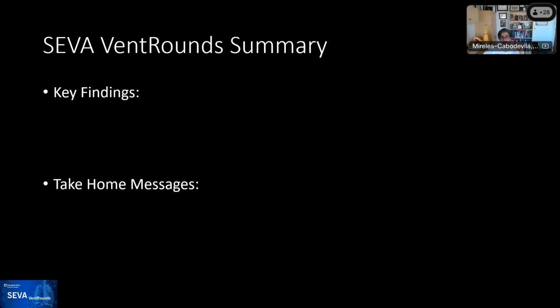So in summary, for all of you, the key findings. We reviewed the PRVC and what type of tag it is, which is PC-CMVa. We highlighted some of the nuances of the mode itself on this type of ventilator.